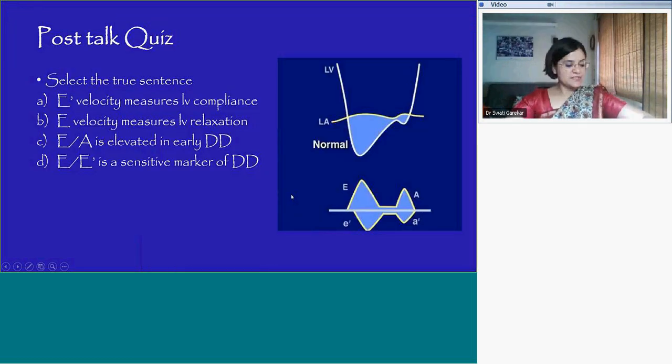It's 3 minutes left to 9, and I'll take a little quiz now. I'll put a box right up here so I can see your answers. First, you select the true sentence. There's only one true sentence.